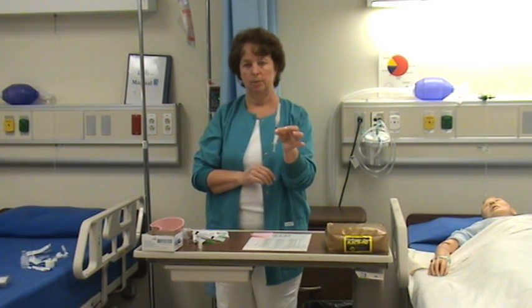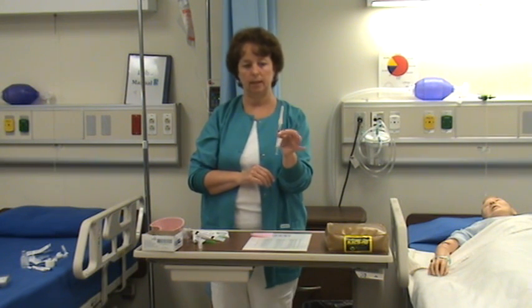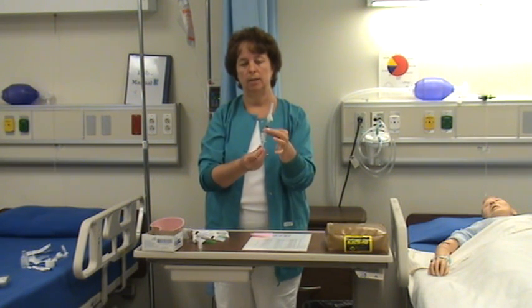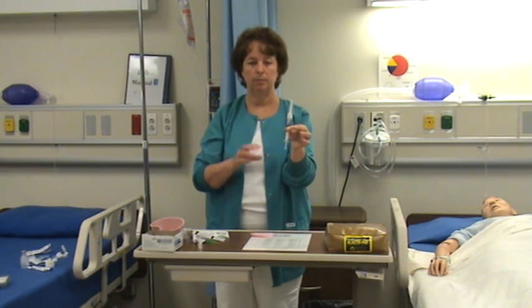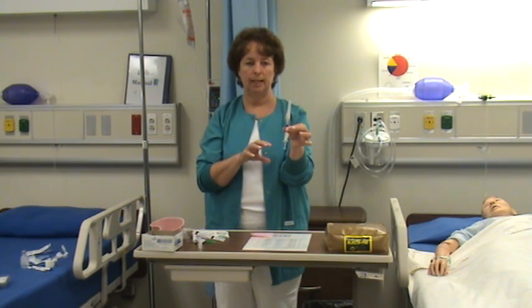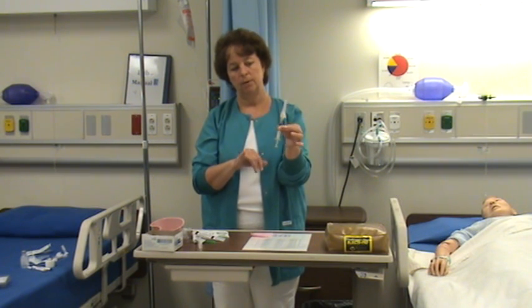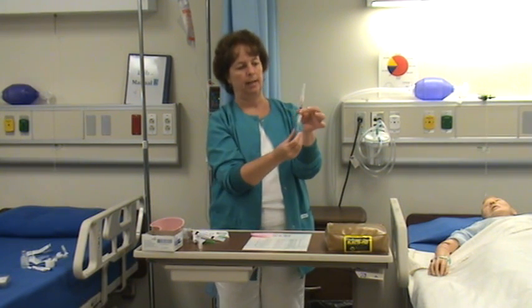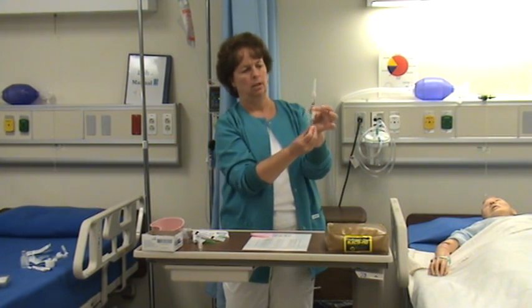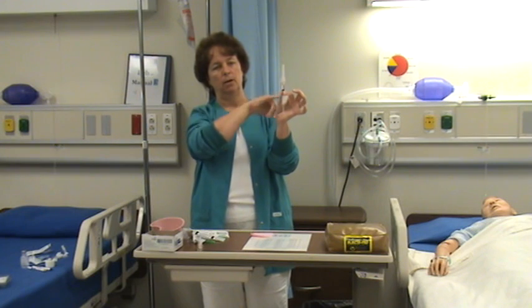Two other variations I want to show you with an IM injection: one is an airlock and the other is a Z-Track. The purpose of both the airlock and the Z-Track are the same — they prevent any medication from getting into the subcutaneous tissue and damaging it. For the airlock, we have our medication at the correct dose and I'm just going to add a little bit of air to the syringe — about two tenths of a milliliter. You can see the air at the top.